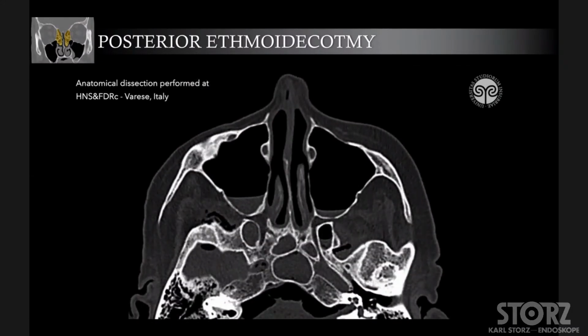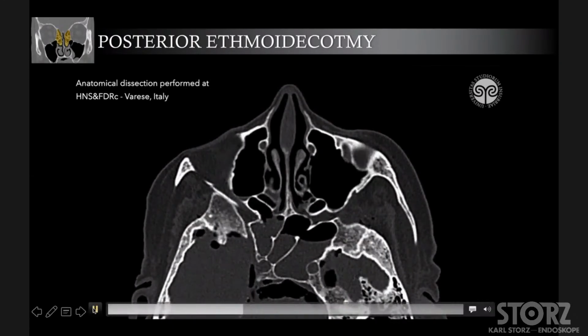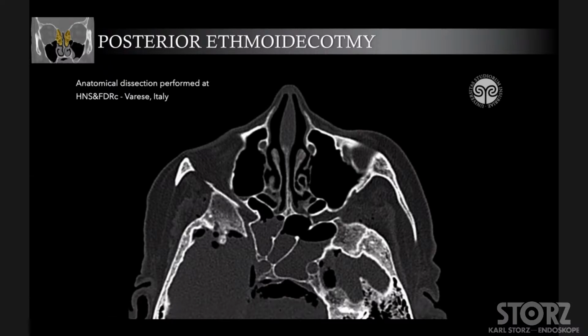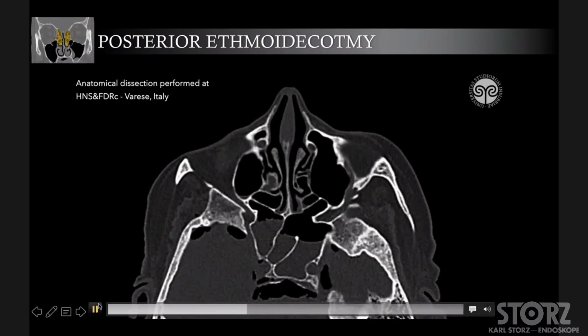Then we can also analyze the axial view of the CT scan. Another important thing, you can see such a septation goes directly at the level of the paraclival carotid artery on the right side. Also here, the intersphenoidal septum goes directly at the level of an internal carotid artery. This anatomical variation should be exactly understood before surgery in order to be ready to manage this situation and also not to perform too much dissection at this level in order not to damage the internal carotid artery.